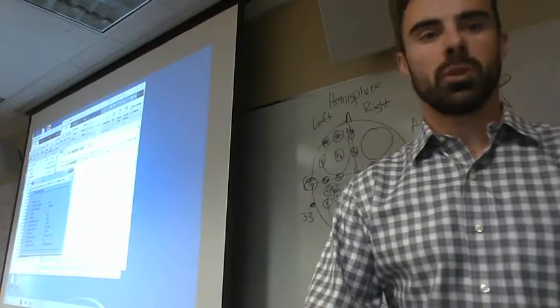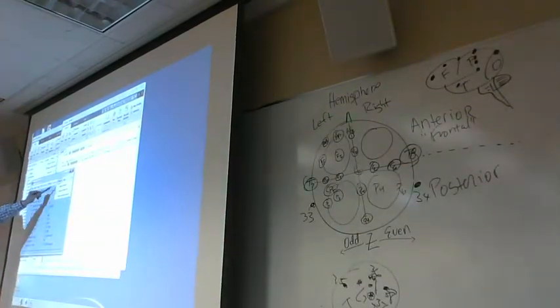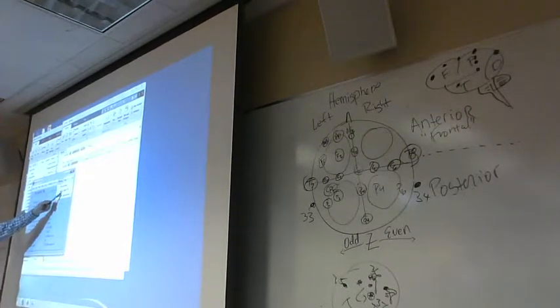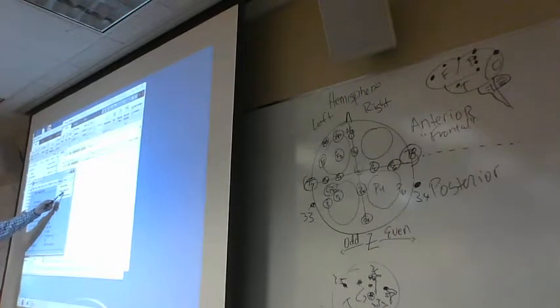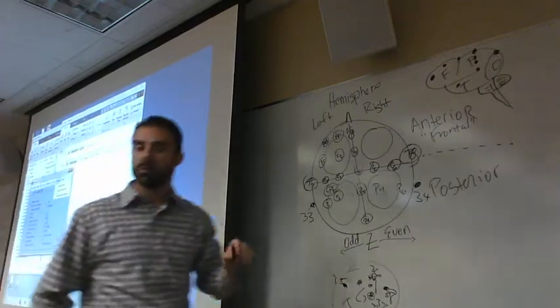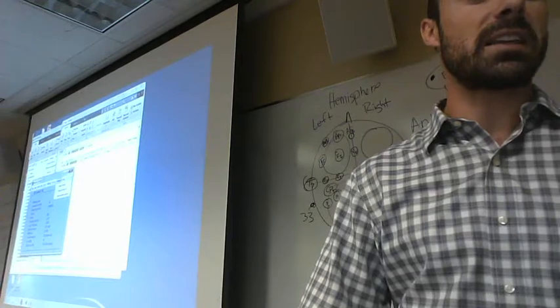Okay, so now we can see that if we click on our data sets, we show our first one that we imported, the subject 4 re-reference that we named, and now we have a new data set we've created, our second one. That's our re-reference data set for subject number 4, and now it's been filtered, particularly with a high pass filter at 0.1 hertz. Okay, now let's make sure we get the output of that too.